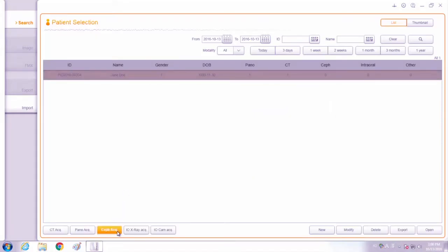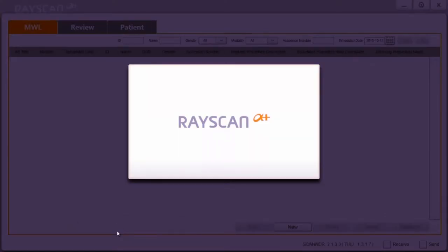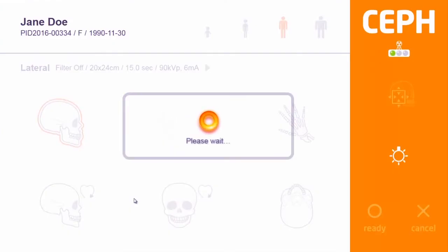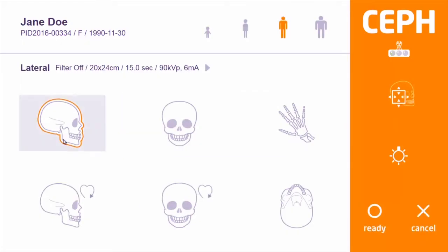Click the self-acquisition button. Verify patient information and click OK. The Ray scan will begin to rotate to the proper position. Click the lateral protocol.